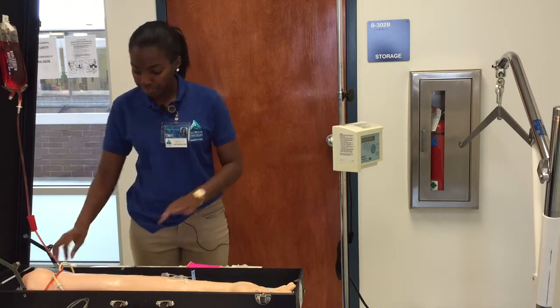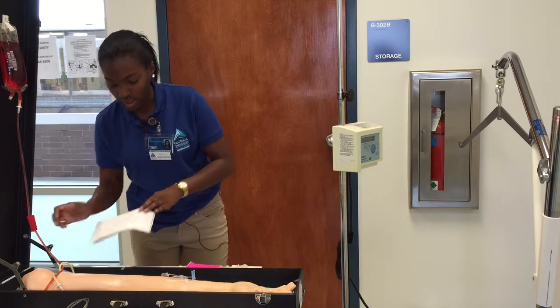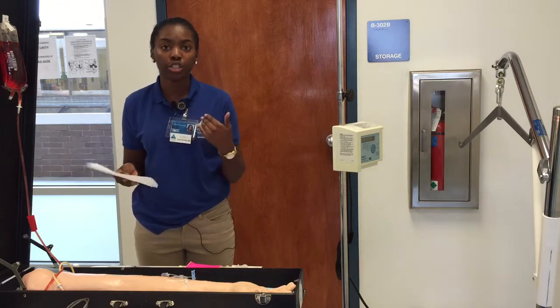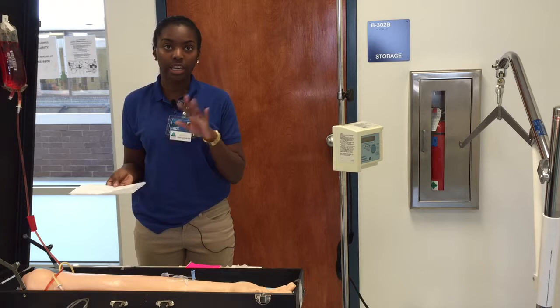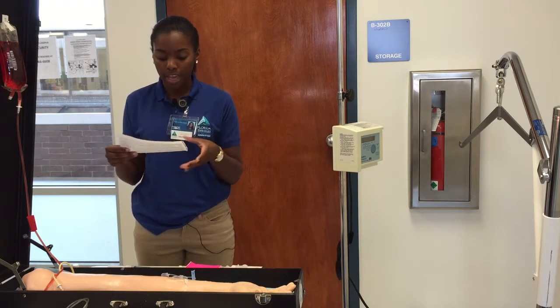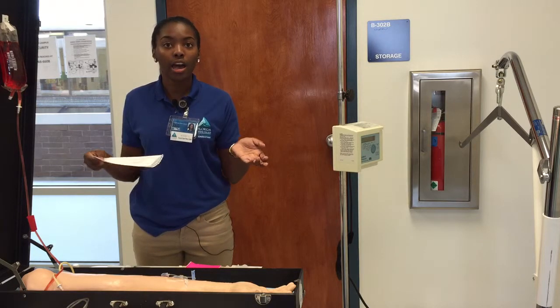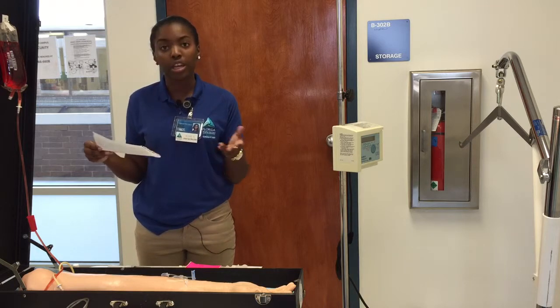And I have my doctor's orders here, and the doctor ordered vancomycin for the patient, so I will assess the lab value, so I'll just make sure the white blood cell count is elevated, and any allergies the patient may have. And the doctor ordered 2 grams, and what we have available is 4 grams per mL, so that comes up to half a mL of medication, and it'll be infusing for an hour.